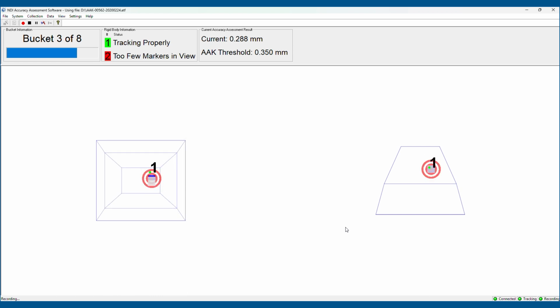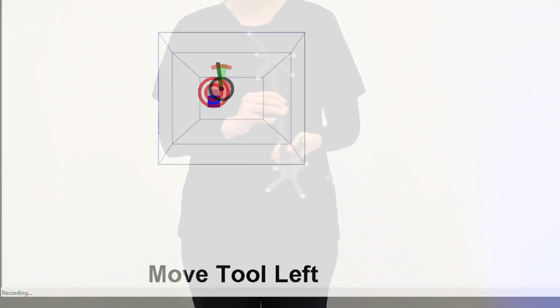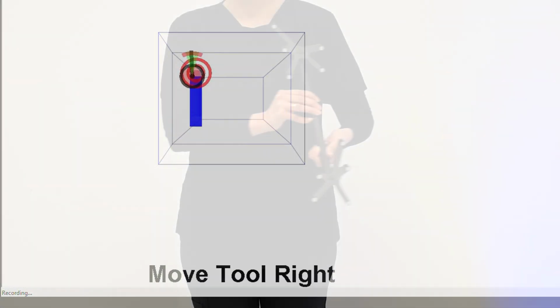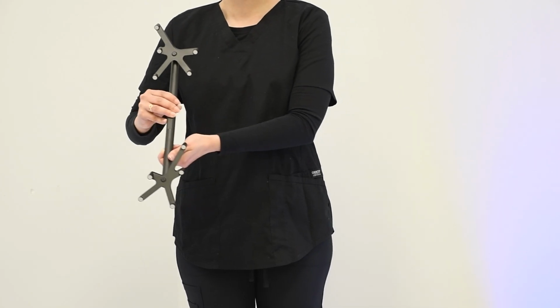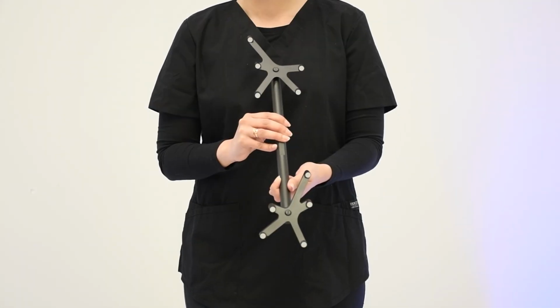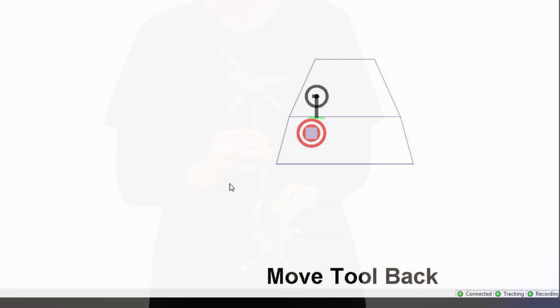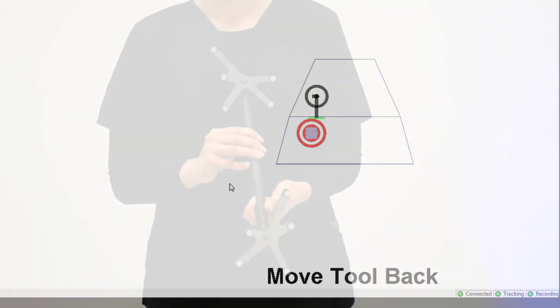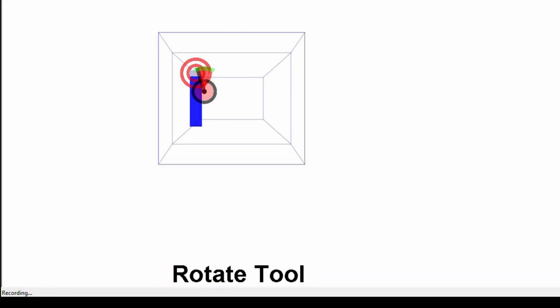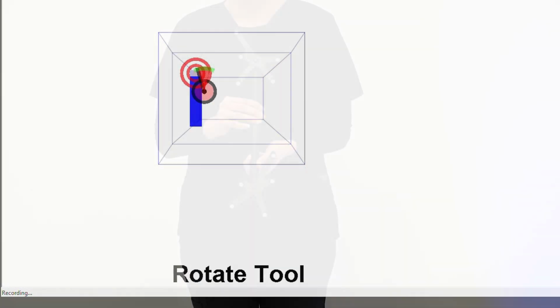placement. Directional hints include Move tool left, Move tool right, Move tool forward, Move tool back, Rotate tool clockwise or counterclockwise.